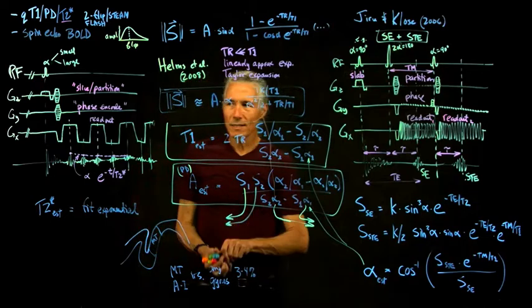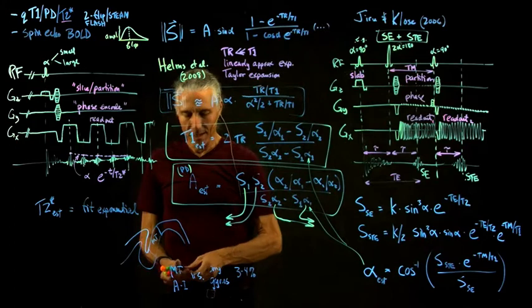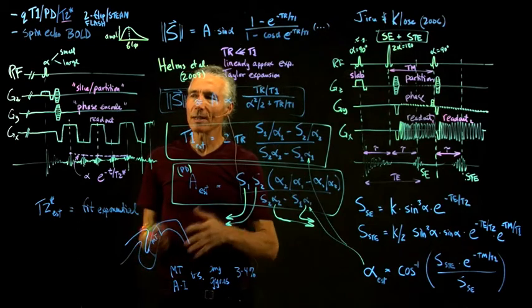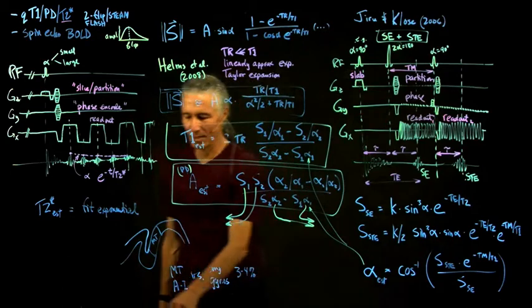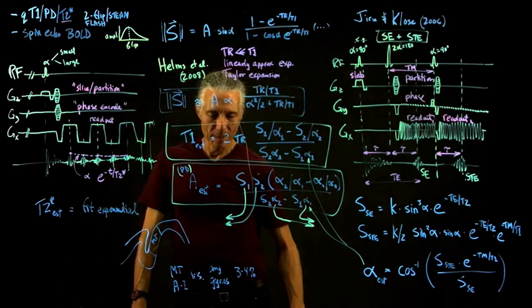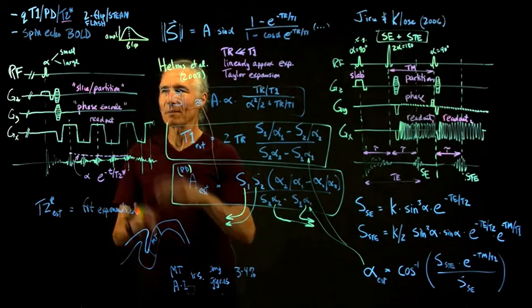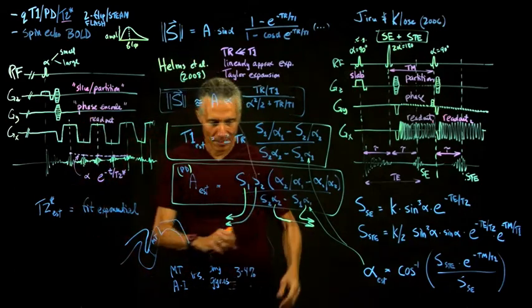And if we're trying to distinguish other areas in between MT, really myelinated, and angular gyrus, really not myelinated, we need to be able to distinguish like a 1% difference. Or if we're looking for a change over time in somebody's brain, we need to distinguish like a 0.5% difference. For something like that, we really do need an accurate estimate. That's a little motivation for why you would go through all this trouble rather than just doing a regular old FLASH scan and just getting one scanner number out and dealing with it.